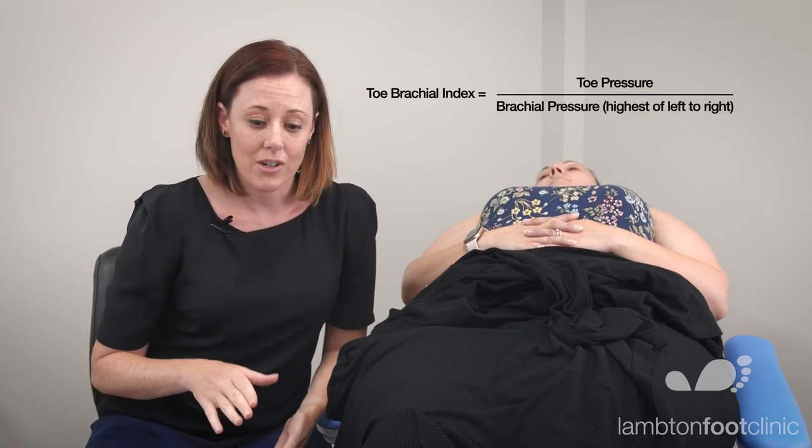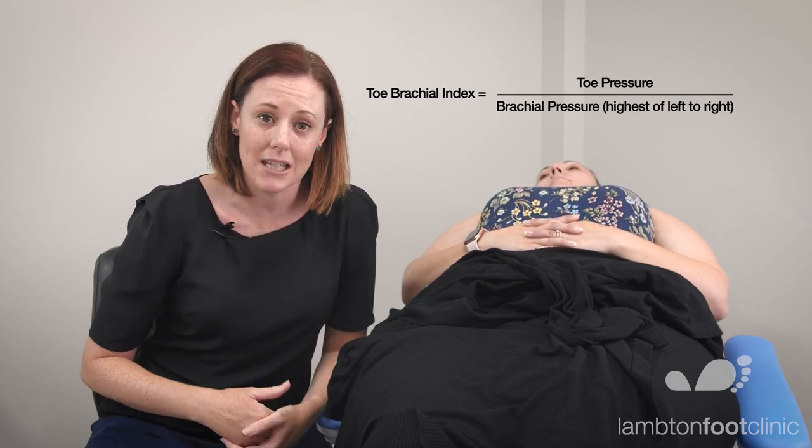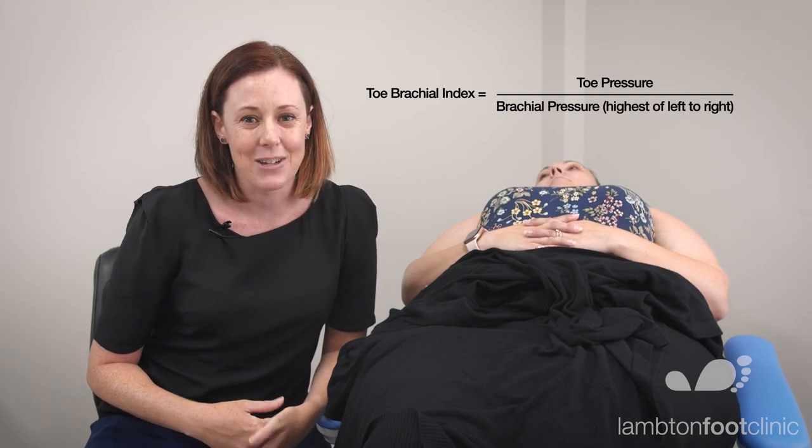So a toe pressure and a toe brachial index should take less than 6 minutes in total to measure. So keep practicing, and thanks so much for your time.